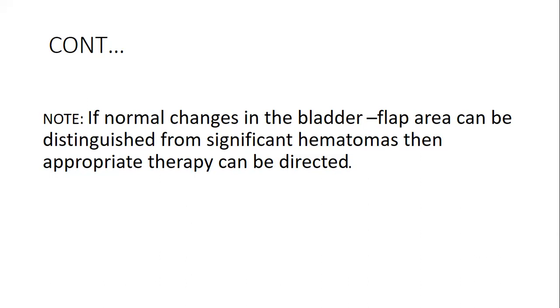So you realize that clinicians won't see the bladder flap hematoma. They won't see if there is anything like endometritis. They will have this clinical picture, but they won't know exactly what is going on. You agree with me that correct diagnosis equals correct treatment. So this is the hallmark of this presentation. Our job is to see, do we have any significant hematomas, or can we distinguish the normal bladder flap area that may be there?